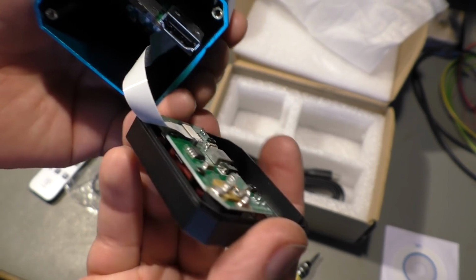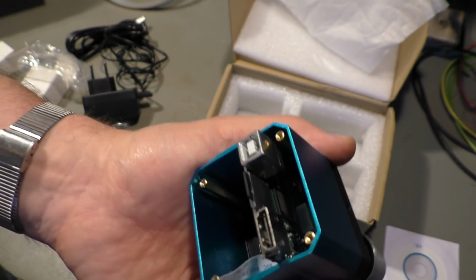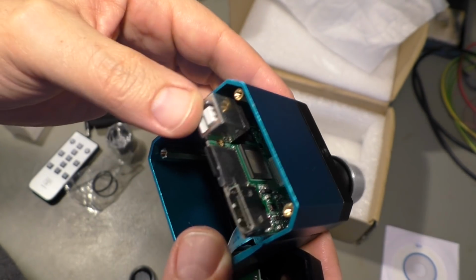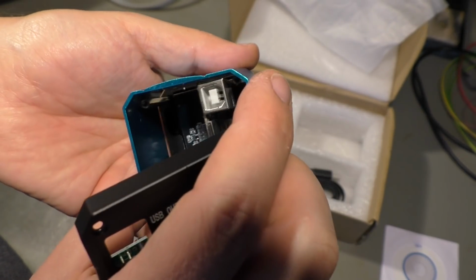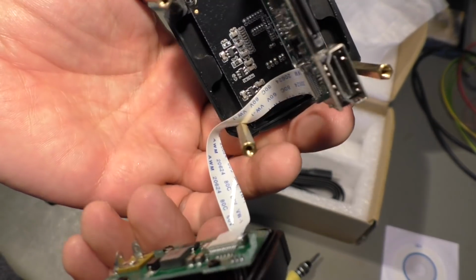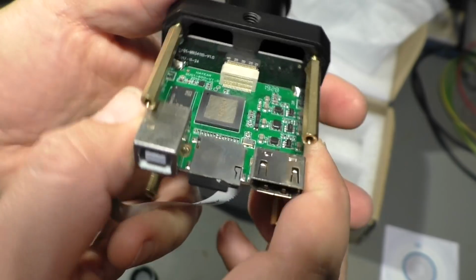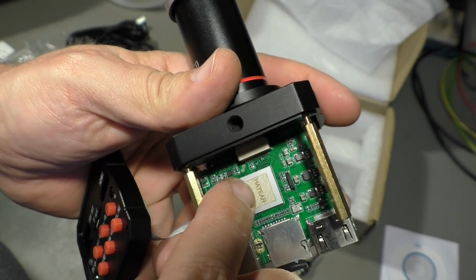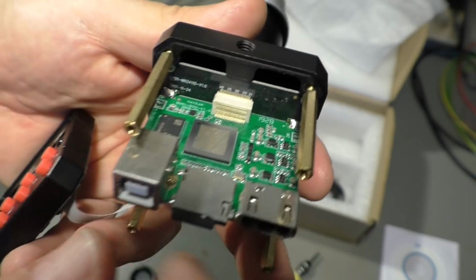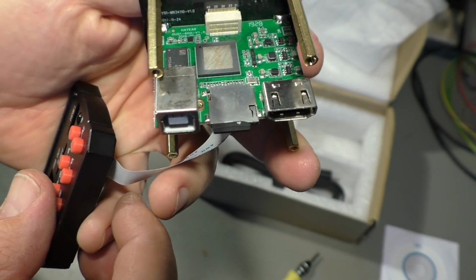Ooh, nice solder job here. We have a big chip there. USB. Okay. That's the case. Well, there is a board for the CCD sensor. There is another board with the Hayear chip, and that's also the manufacturer of the entire camera. It has a connector, but the boards are soldered, so they can't go loose.